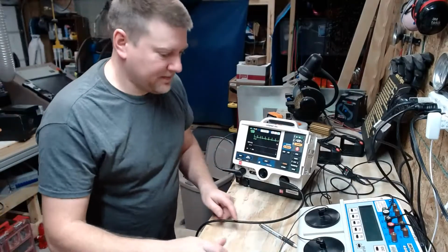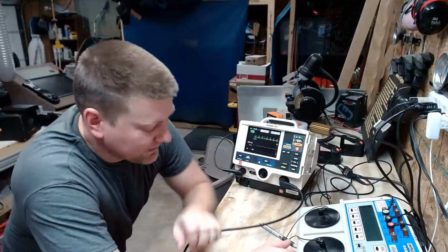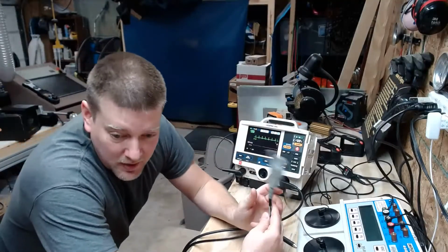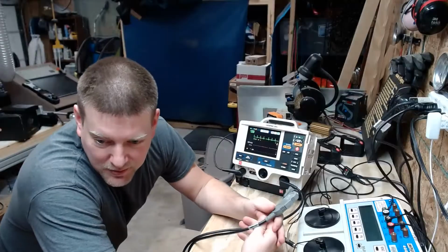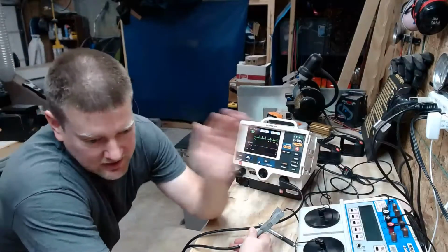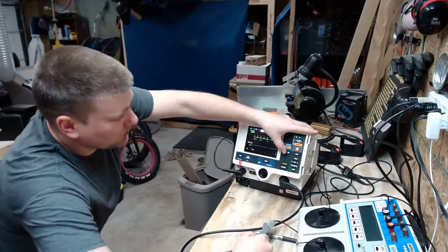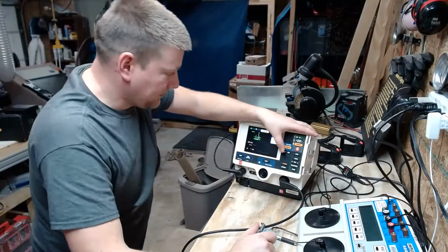All right, guys. As I was saying, you can monitor the heart through either your cable or through your ECG leads, which I have currently hooked up. And you switch between those using the lead button.